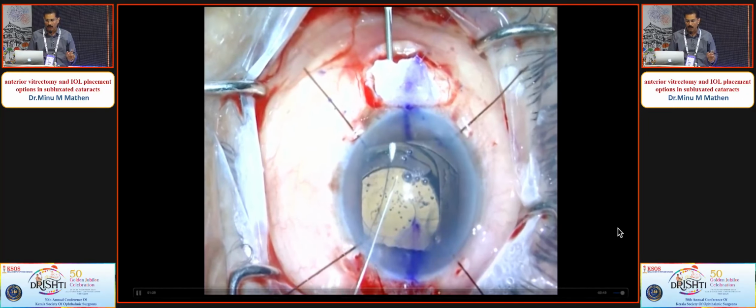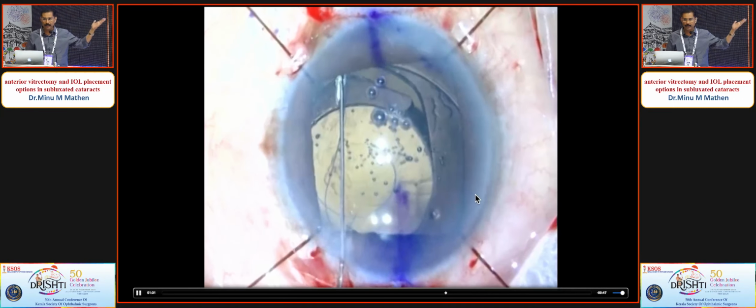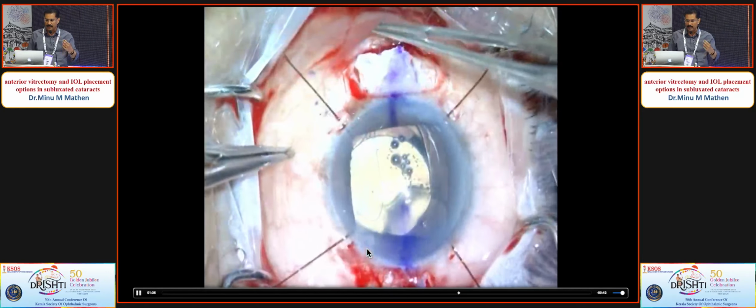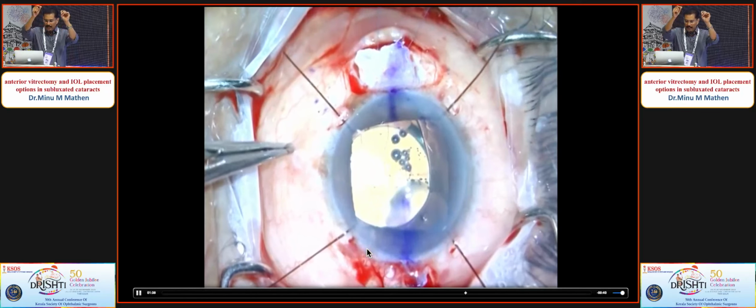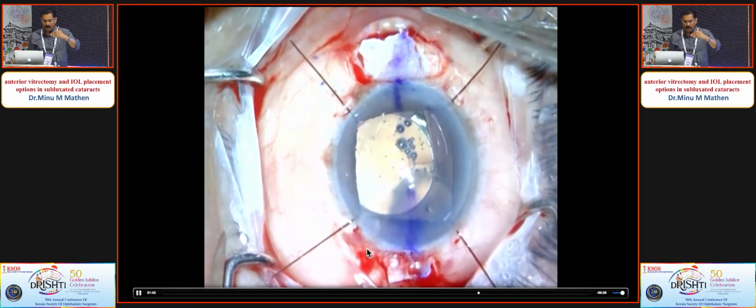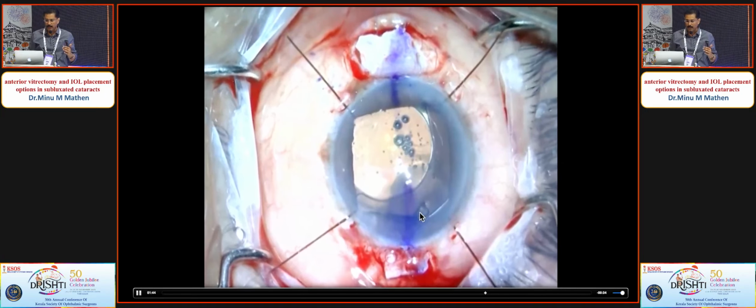This time the hollow needle comes above the complex, and the needle goes again back through a paracentesis, and this will form a loop and you can pull it on. And now just give a little traction and center it, and you can decenter it a little bit so that you can see this part more clearly.